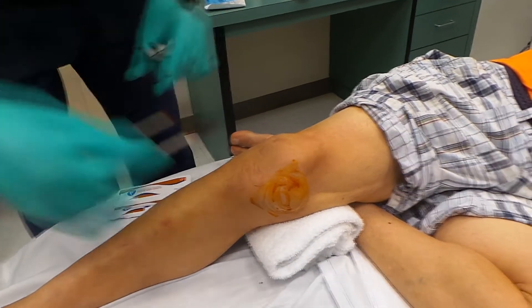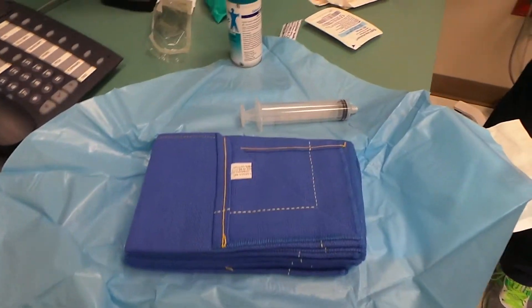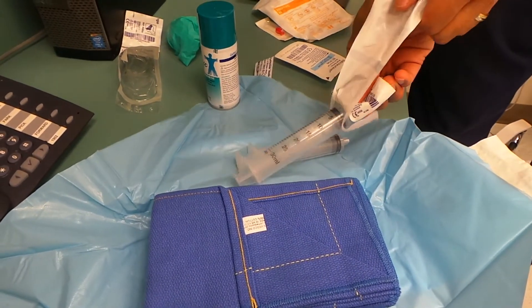That will really show the audience what it looks like as the needle goes in. We may only need one 30 ml syringe, but I've got two.